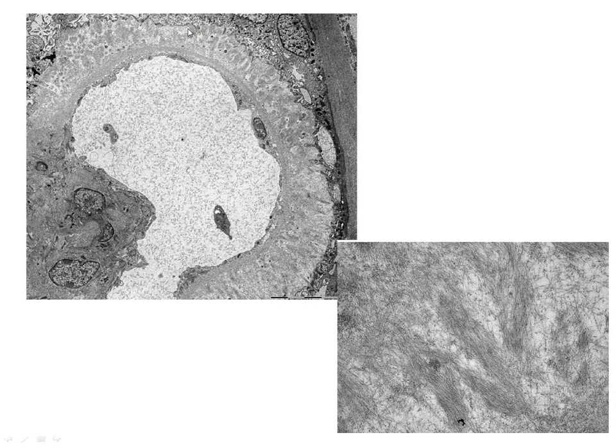And then the final thing is to go back just conceptually to focal and segmental glomerulosclerosis. That again is a pattern of injury. In people medicine, they have an in-depth understanding of a lot of different underlying causes and possibilities. We in veterinary medicine are just at the beginning of the discovery of the kinds of things that cause it, but more importantly, which are common and which are uncommon.